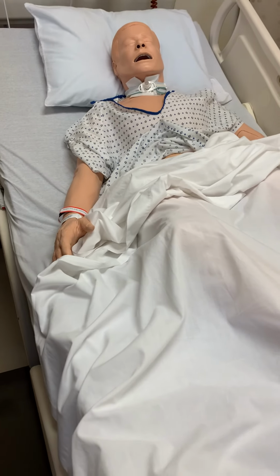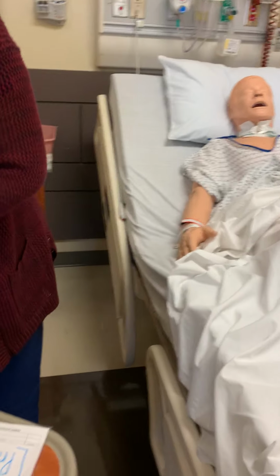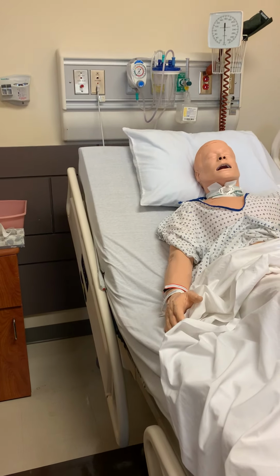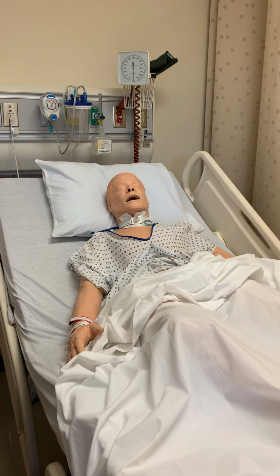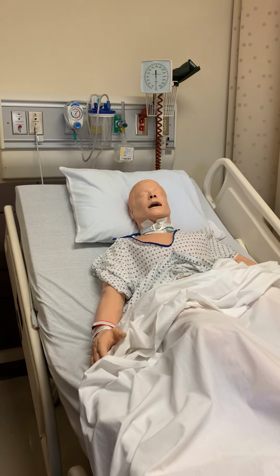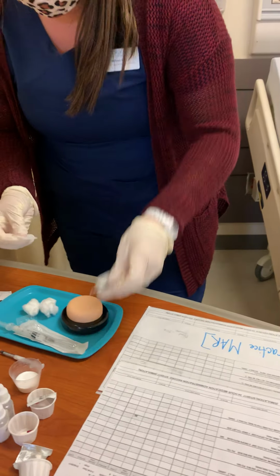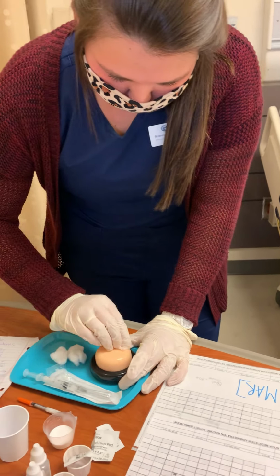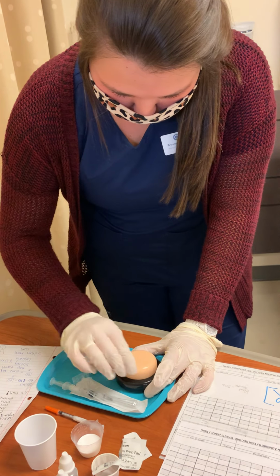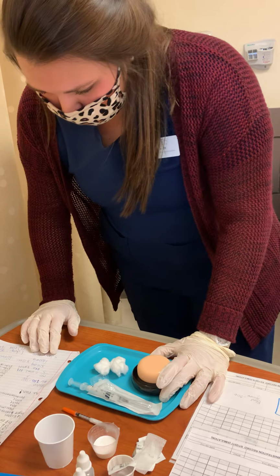All right. Now, next, we just have your IM medication. I'm going to clean my injection site in one direction for 5 seconds. All right.